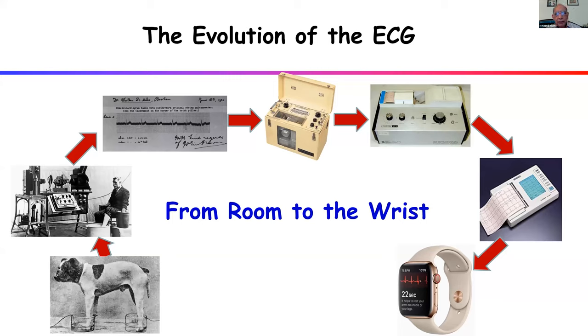This is now a very fundamental medical test and parameter to judge, to follow, and to monitor patients of heart disease, not only heart disease, but many other diseases.